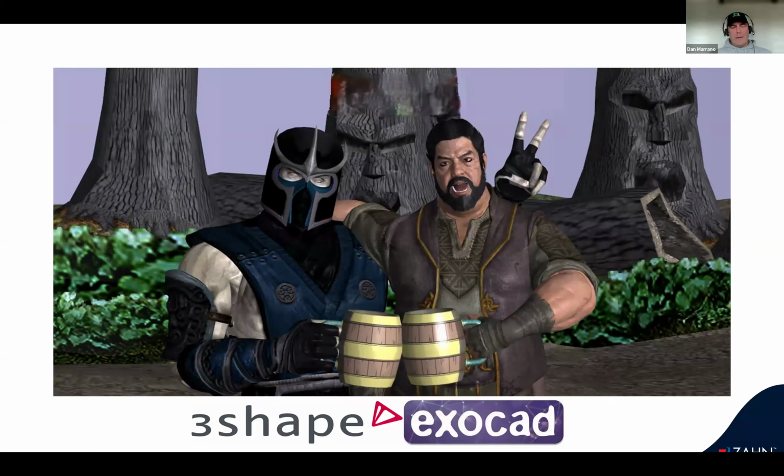And again, I really think it's important that we try to bridge this gap and integrate them both. Your lab will be much more efficient and productive for it. It's really been a nice thing for us. And it has options. Some people think one's easier than the other. You'll really find your techs will probably enjoy learning a new software and being able to implement it when they have struggles with one of the others.